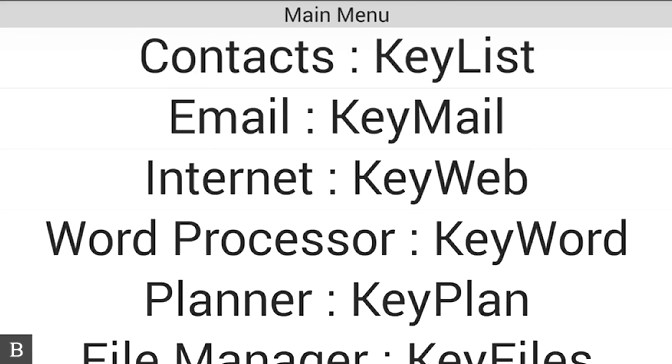This is going to be an exciting snapshot video because we're going to do something that has never been able to be done on a traditional Braille device like a note taker. We're going to talk about utilizing some of the power of the BrailleNote Touch being a Google certified device.